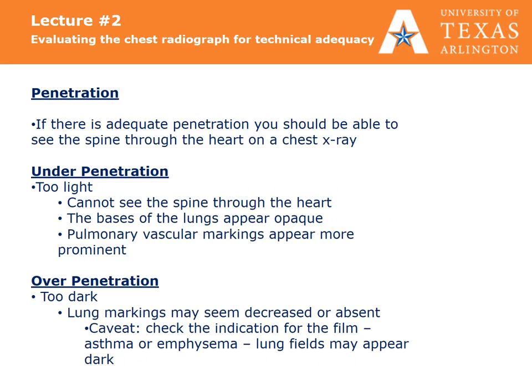If a chest x-ray is adequately penetrated, you should be able to see the spine through the heart. You will know that a chest x-ray is underpenetrated or too light if you cannot see the spine through the heart or the bases of the lungs appear opaque. Remember, this artifact could either mimic or hide disease in the lower lung field. So look closely at the lateral chest x-ray. Pulmonary vasculature markings appear more prominent than they really are on a light x-ray.